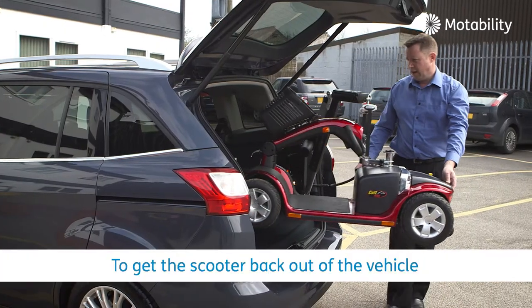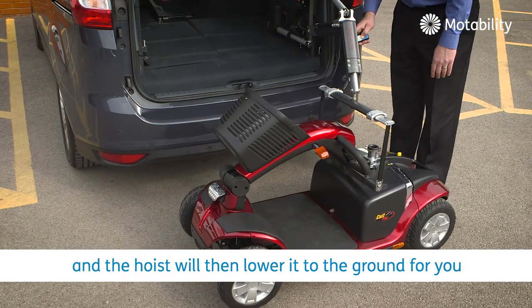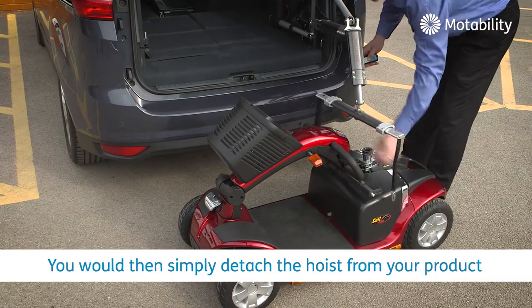To get the scooter back out of the vehicle, you would guide it back out of the boot and the hoist will then lower it to the ground for you. You would then simply detach the hoist from your product.